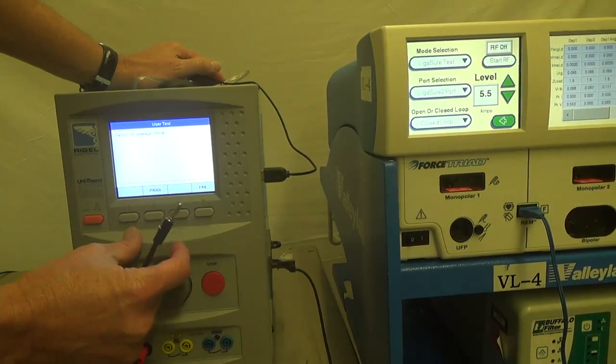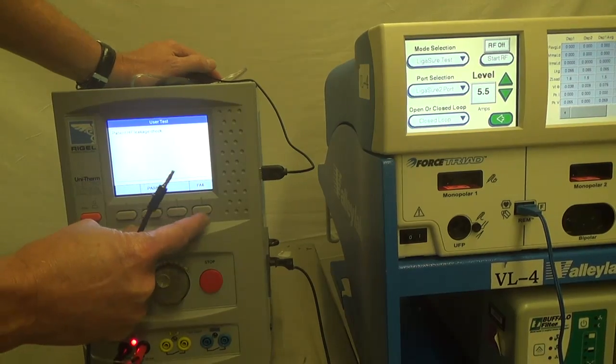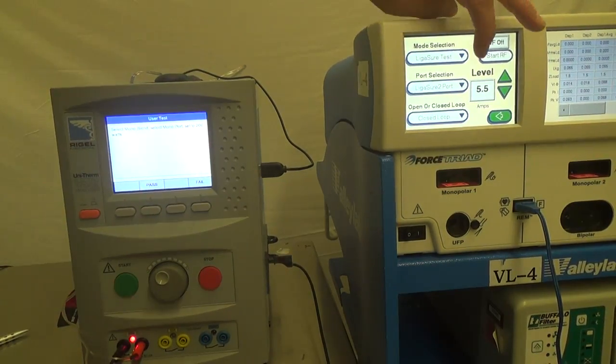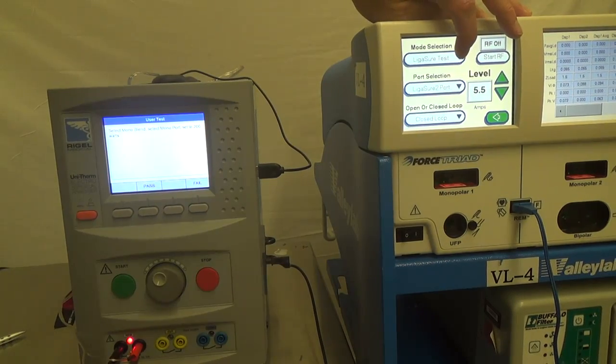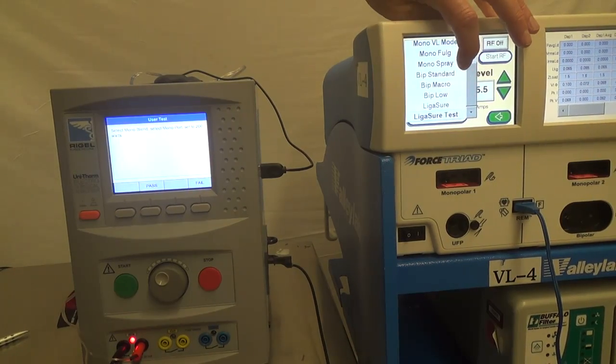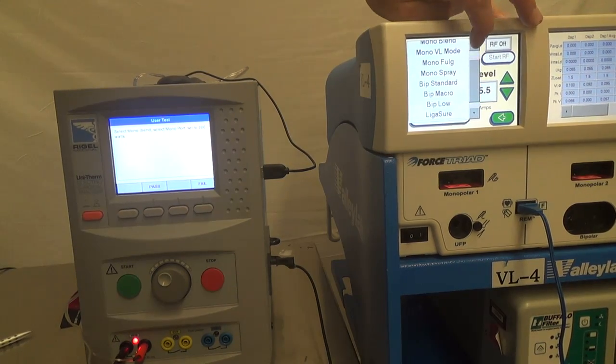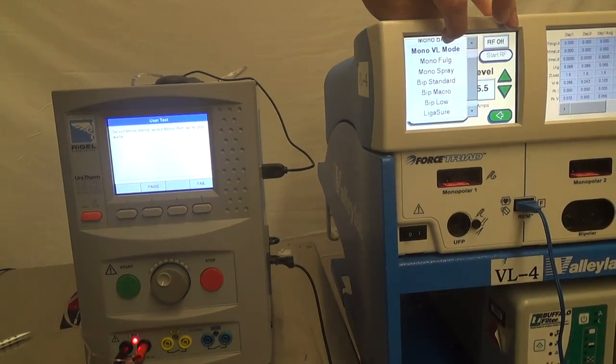But in the book, they call it the patient HF leakage. So we press pass. Now we select mono blend. So we go to the mode selection. We go to mono blend, which is right there.